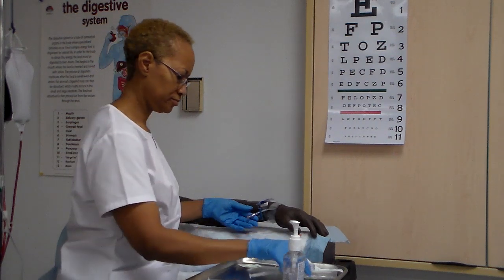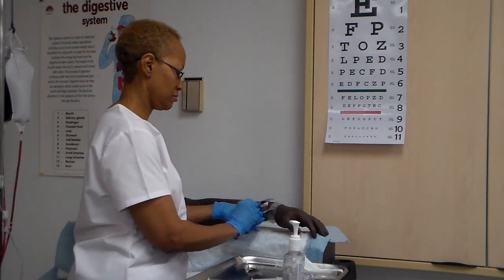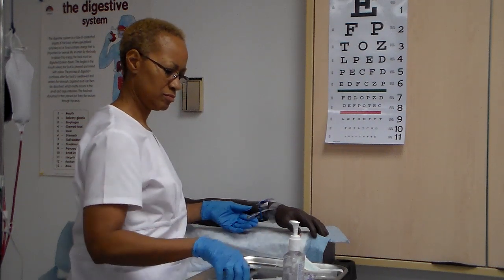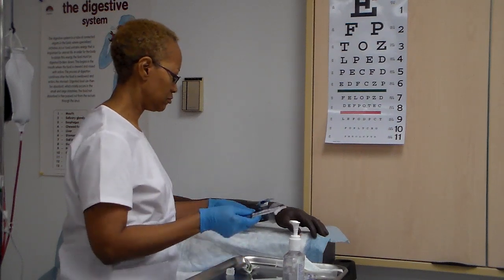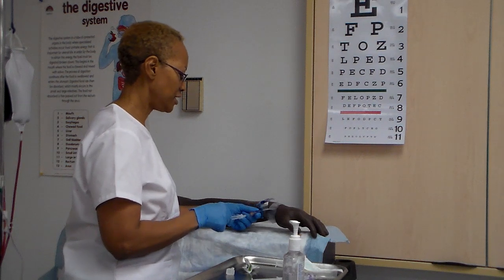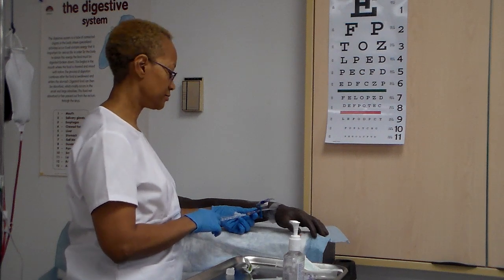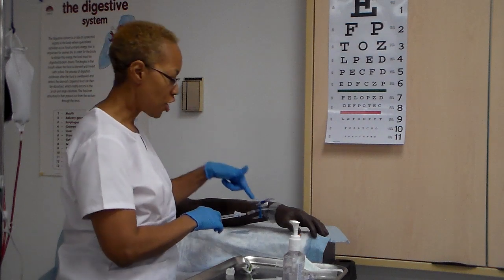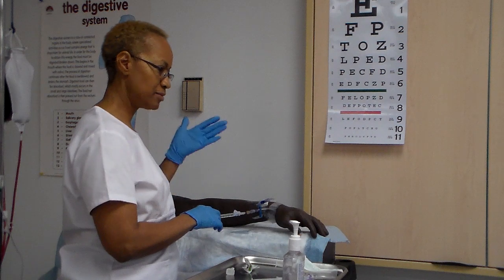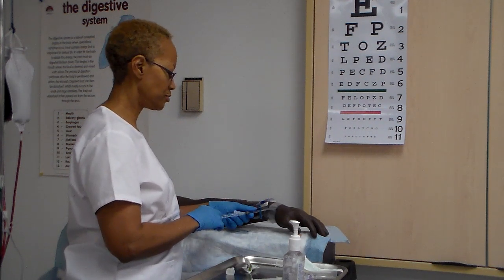Clean the lock injection port with antiseptic swab. Attach syringe with normal saline and inject normal saline flush at the same rate the medication was delivered. Why not any faster, do you think? Exactly. Because it's medication in that line. And if I just flushed it quickly, all that medication that was in there is going to quickly go into the vein. So the same time that you use to put the medication in is the same time that you use to put this flush in.